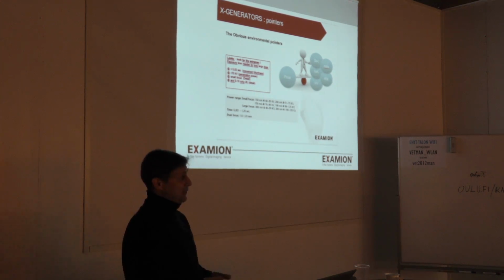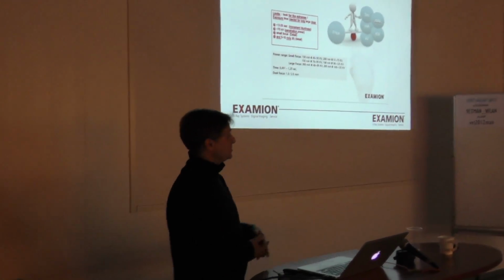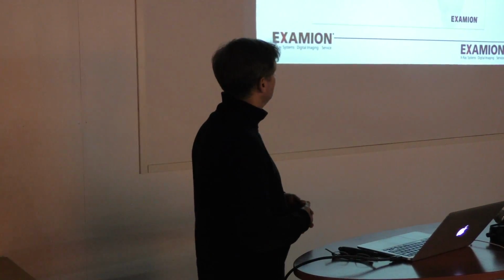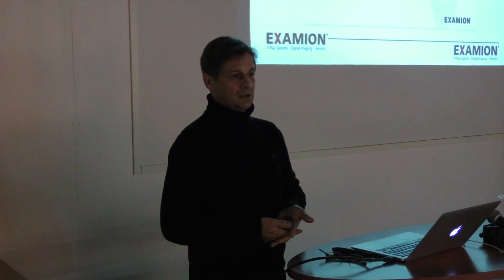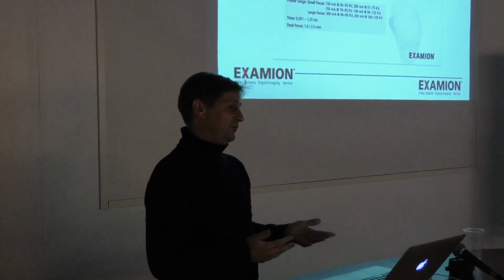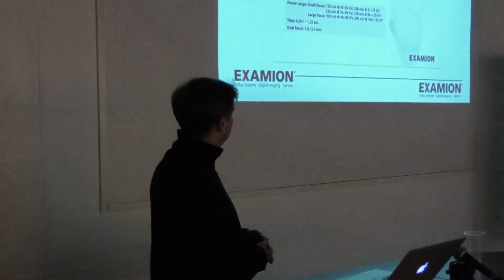And then the penetration power, well, we don't need too much kilovolt on a machine, to be honest. You just need enough to get through the animal. Most animals, you can actually get through them if you have something around 70 kilovolts, sometimes 80 kilovolts. So within that range, you do not need 140 kilovolts to X-ray, let's say, a normal animal. And then the other point is a small focus, because focus is detail. And then again, you're also looking for the mAs values.